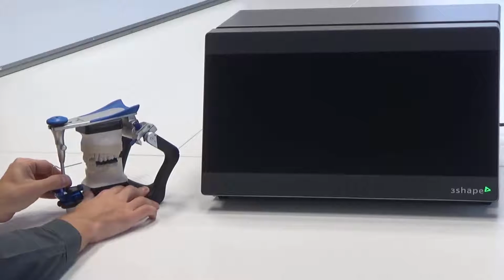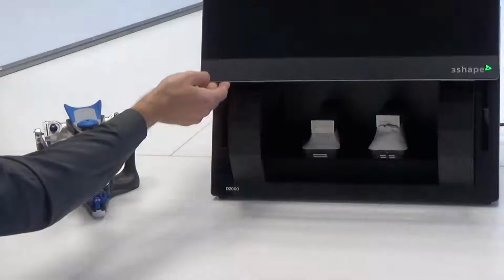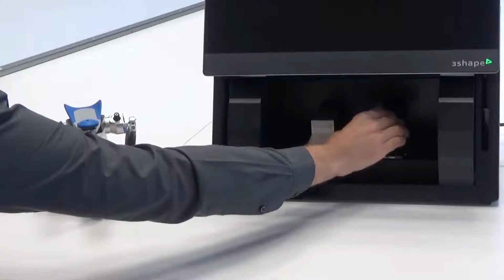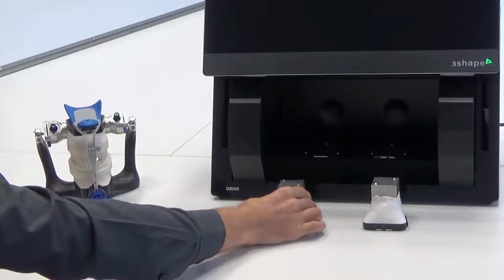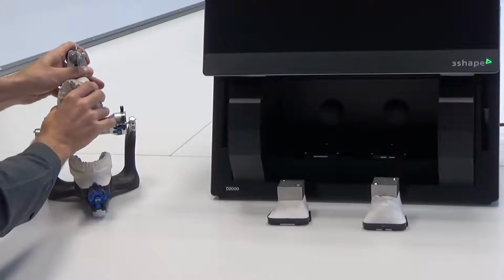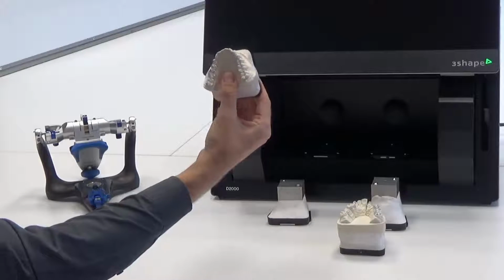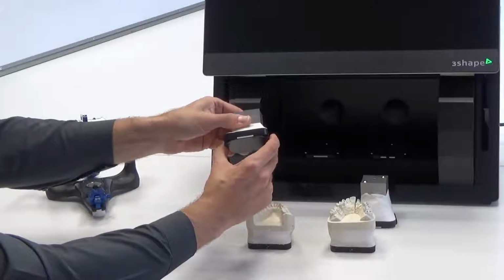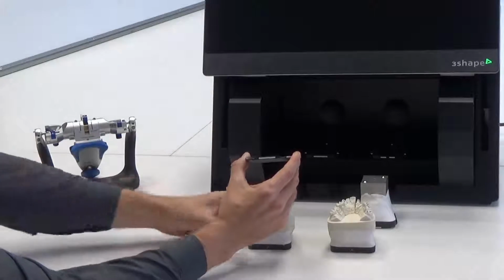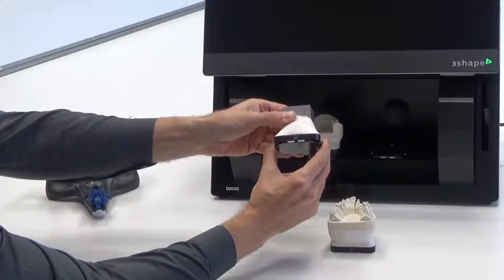You can check the occlusal contacts using occlusal paper, and then use the contact points as reference points in conjunction with the digital scan. Remove the Occlusal transfer calibration object from the scanner, set the mounted models on transfer plates and insert the models in the scanner. A height adapter is not required during that process. The lower model should be set on the left side and the upper on the right side.